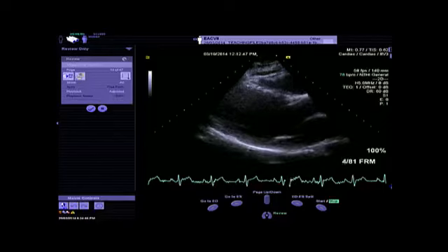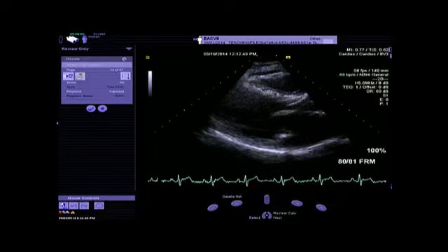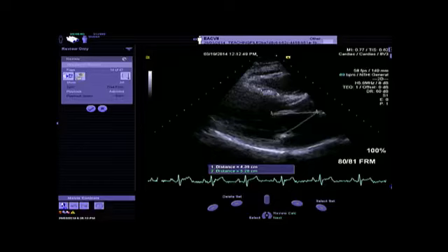For doing the measurement, what you just need here is to have the length of the anterior leaflet in diastole. And you can measure here the length of the anterior leaflet. And you have to compare this length to the mitral annulus and take care of this calcification. This is a calcification that is at 2 levels, so the annulus but also the ventricle. And you can see here the clear junction of the mitral annulus that is here.